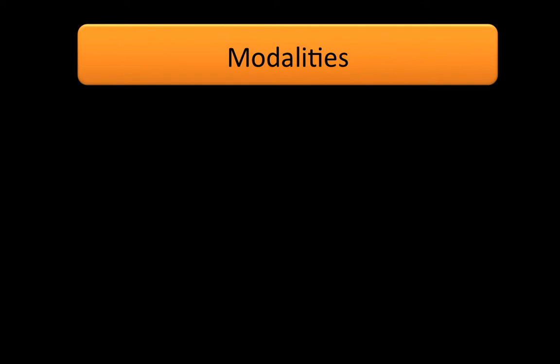Anyway, I think chest X-ray is quite a common investigation that our clinicians and physicians usually advise for their patients, and it contains very vast information. There is quite a lot of information that we get from chest X-rays, and I am going to describe how to read a normal chest X-ray, and after that, I will try to show you some quite common abnormal cases that you can find in your departments while working with patients.